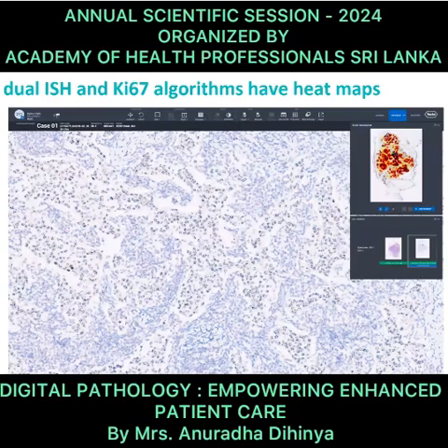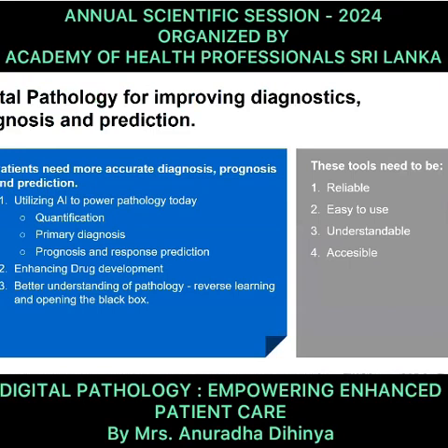But for the challenging cases, where the score is between 1.8 and 2.2, it becomes very challenging. The heat maps help you out with where to look, whether to look into the orangish area or the yellow area. You can make your region of interest and give the score.